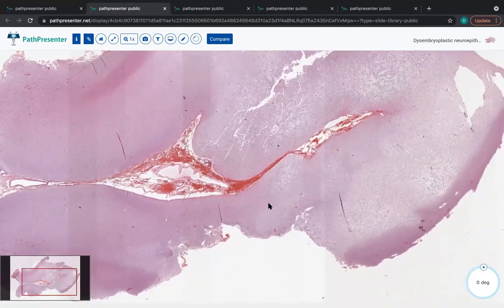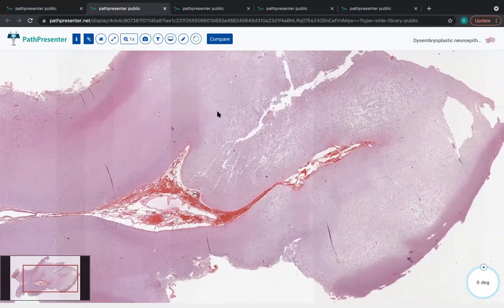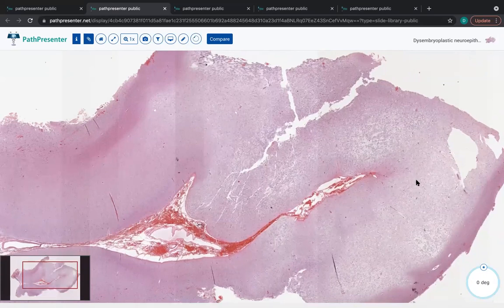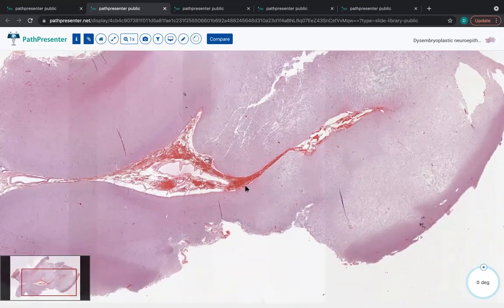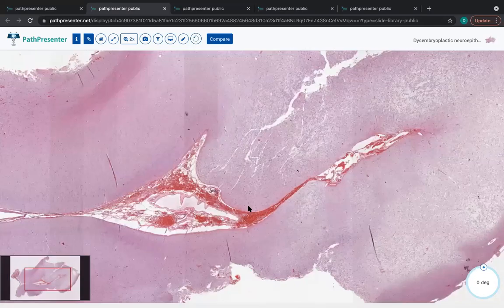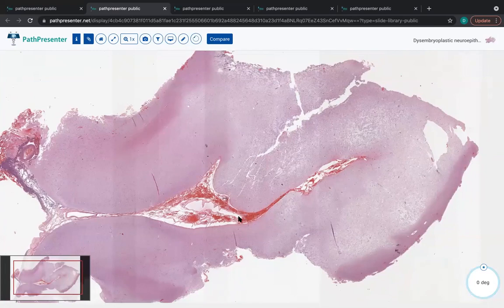And at some point in their clinical history, they'll get imaged and they'll see this very sharply demarcated, cortically based space occupying lesion. So you can see from this en bloc section, this is a sulcus. So you see the leptomeninges here in this tissue fold. And here's an expansile mass. It looks like it's localized within the gray matter and just filling up this region of the cortical ribbon.